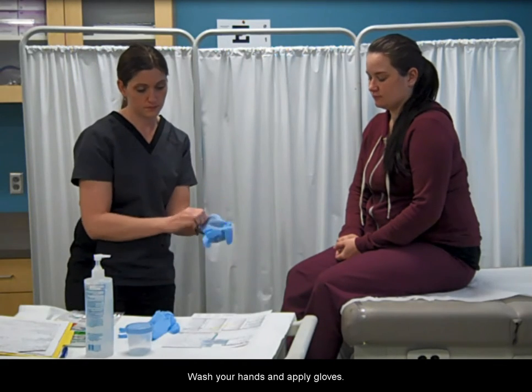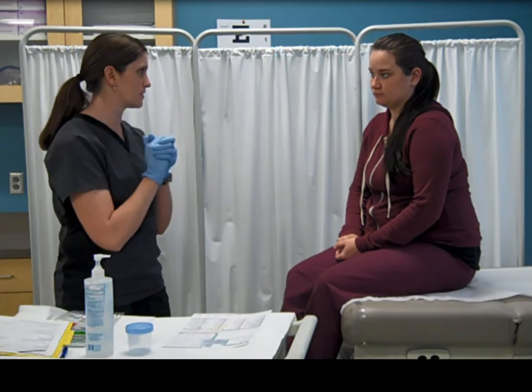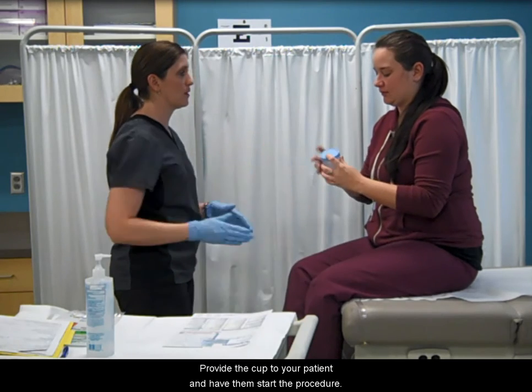Wash your hands and apply gloves. Provide the cup to your patient and have them start the procedure.